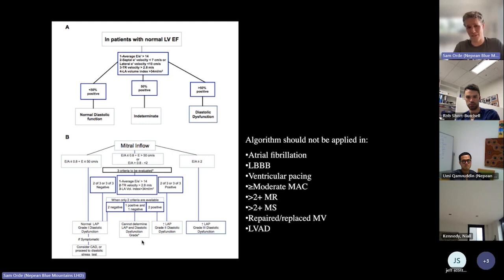I preferred these guidelines to 2009 because it left less room for ambiguity. And what I mean by that is, rather than just relying on one value, which was the E to A ratio, this one's got an idea that you can actually pool them together. And particularly that's useful in the critically ill, I find, because sometimes the left atrial volume isn't dilated.